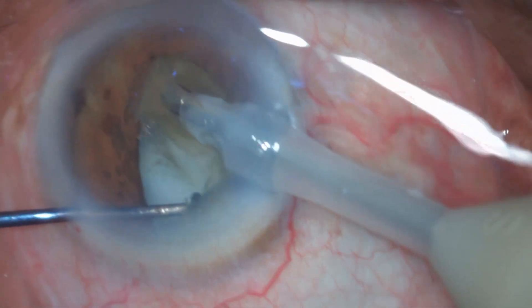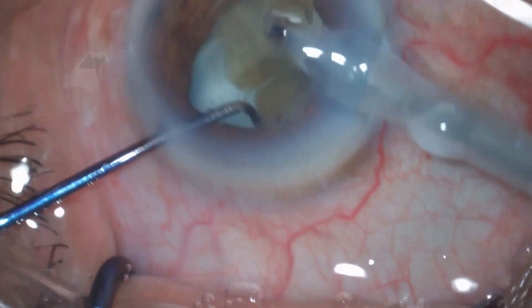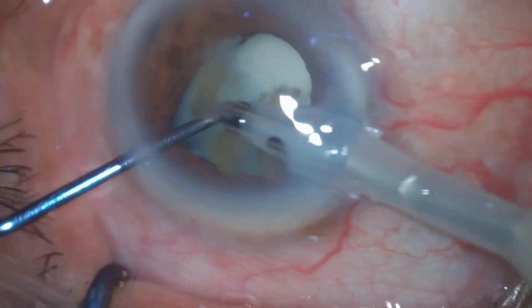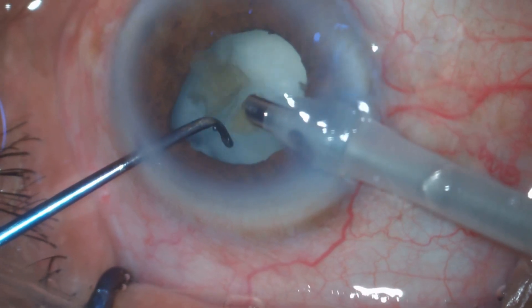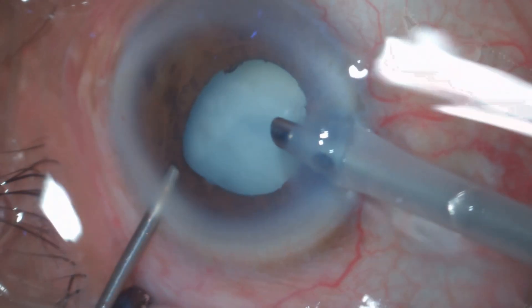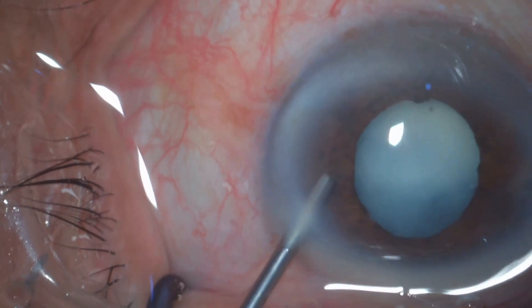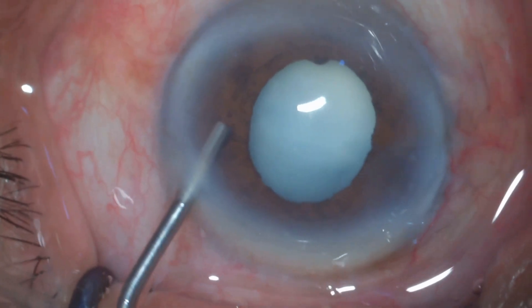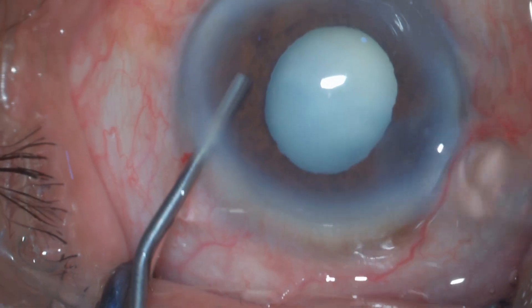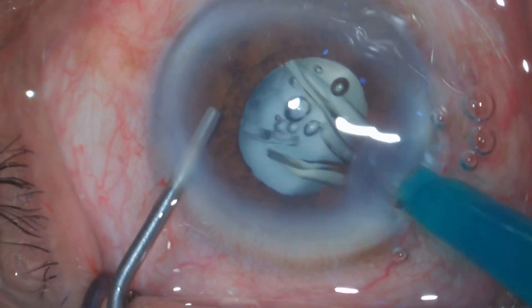I don't know what to do at this stage, because I have seen this in many patients, but those had only a little leak whereas this patient is having quite a big leak into the posterior cavity, into the vitreous. Before coming out of the anterior chamber, I'm injecting viscoelastic material into the anterior chamber to prevent collapse. Now it's time for IOL implantation.